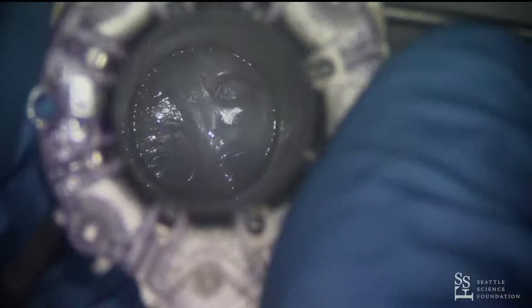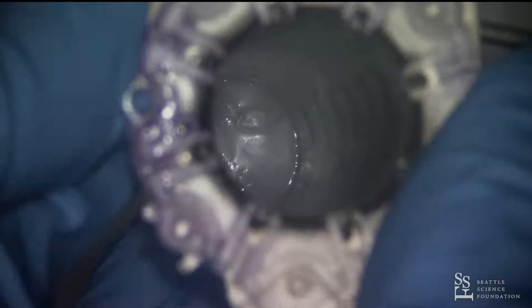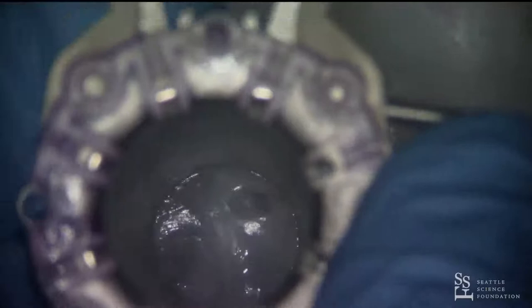Now we're focused at depth, and the robot can follow as you move the tube. At this point you'd use single-shaft instruments — an ultrasonic aspirator is nice, suction is nice, and you can get a bipolar down the tube though it's a little awkward. I'll pull out endoscopic endonasal trays for a variety of single-shaft instruments. Ring curettes are especially nice when working on a tumor.